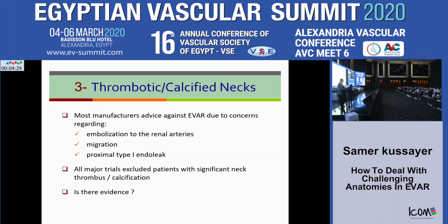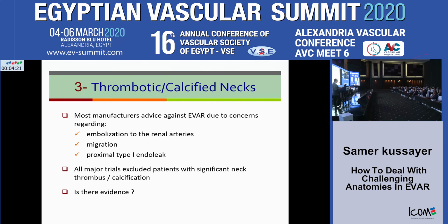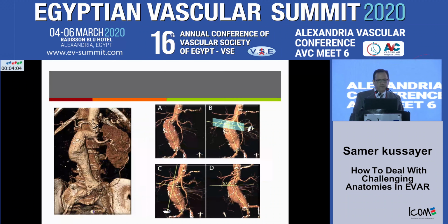What about if you have thrombus and calcification? We know that most manufacturers advise against EVAR, with concern regarding embolization, migration, or proximal type 1 endoleak. But is there any evidence? If you look at this paper from the Journal of Vascular Surgery, they looked at the influence of neck thrombus on the clinical outcome, and they found no significant influence on short-term or mid-term EVAR results if you have thrombus at the neck of the aneurysm.